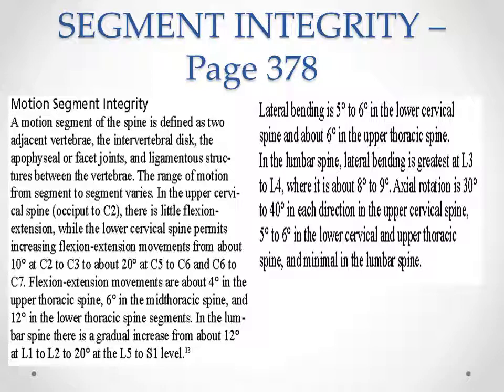Now, for analysis of motion segment integrity, we're going to be concerned primarily with flexion and extension movements. And even though the AMA guides describe lateral bending and rotation movements, we really have no way to assess those motions with the radiographs that we're going to be taking.